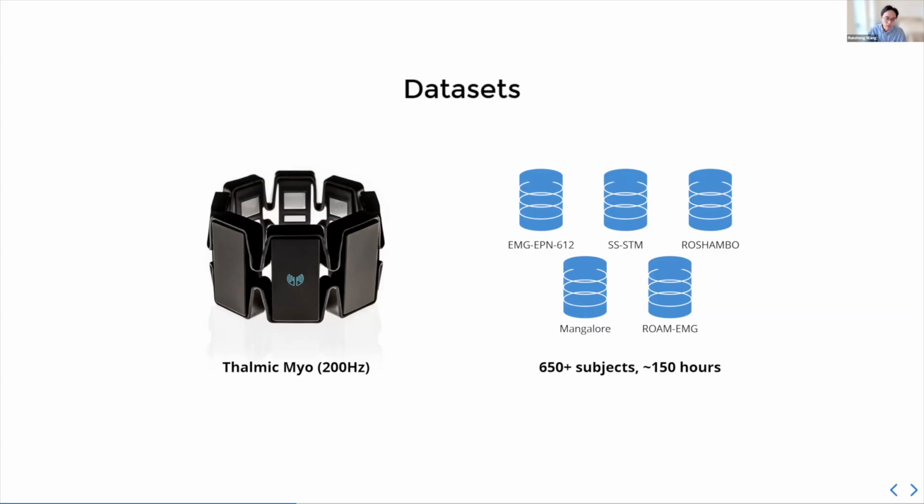But the biggest benefit with using Thalmic Myo is that we get a lot of data sets from other labs, other people, other open source data sets that have accumulated throughout the years. And specifically, we use 5 data sets that I'm listing on the right. I won't go into too much detail, but together they provide us with over 650 subjects and over 150 hours worth of EMG data, which is quite a lot in EMG.